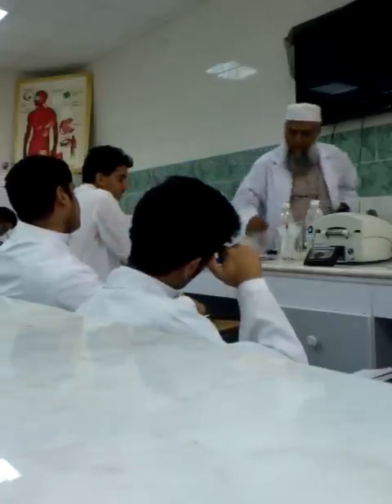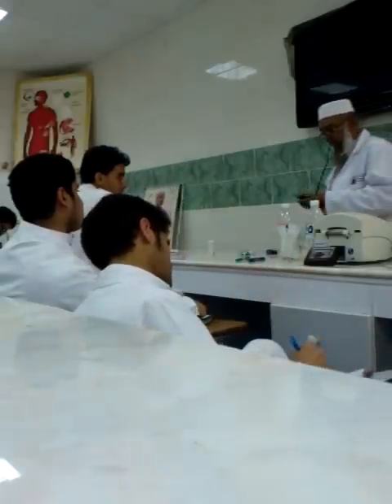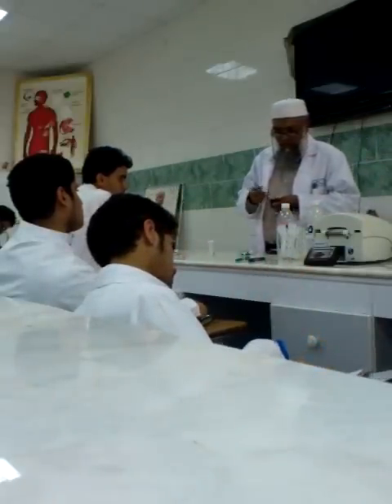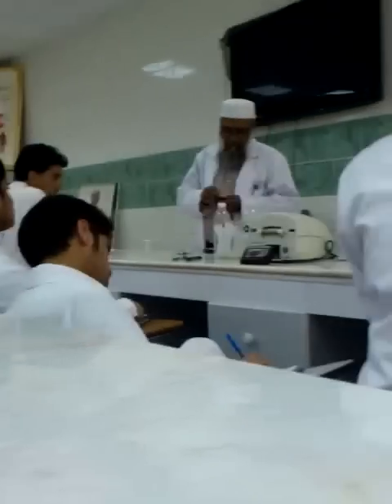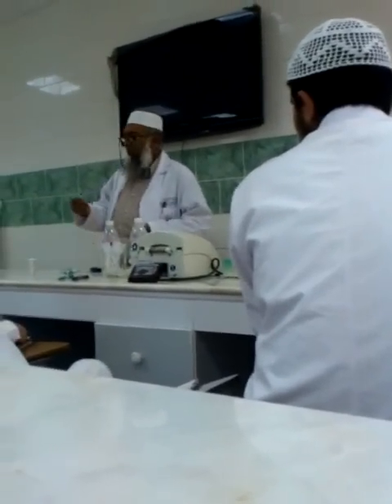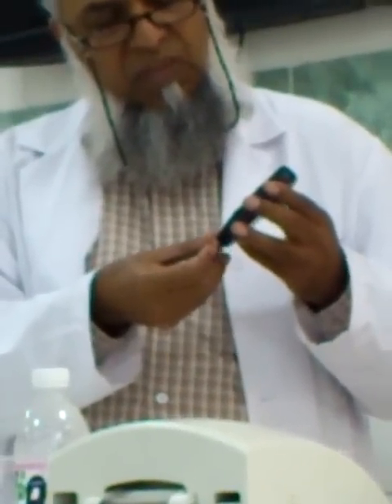Now, last point about it, how to use it. In order to use it, you take the glucometer, you take your glucose strip and you insert the strip here.